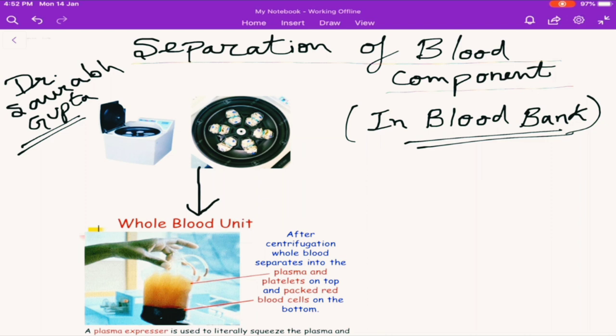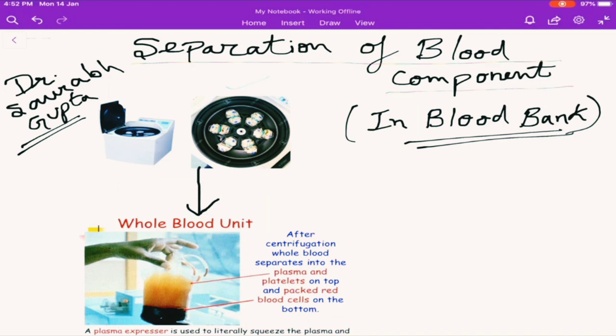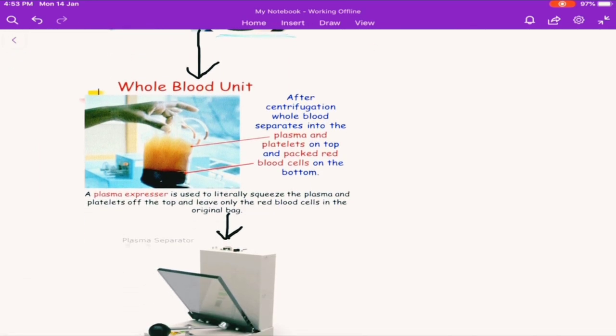Inside the blood bank, after the blood donation, once the blood has been carried to the blood bank, the lab technician puts the whole bag inside the centrifugation machine. You can see right here — this is a centrifugation machine. Look inside: there are some components, some chambers, in which the blood bags are placed. Once the lid is closed, it is centrifuged. What you can see now is how the whole blood looks after centrifugation.